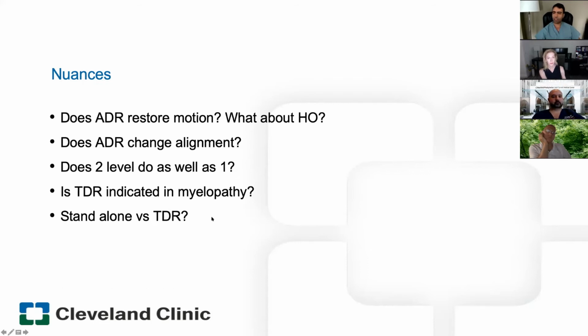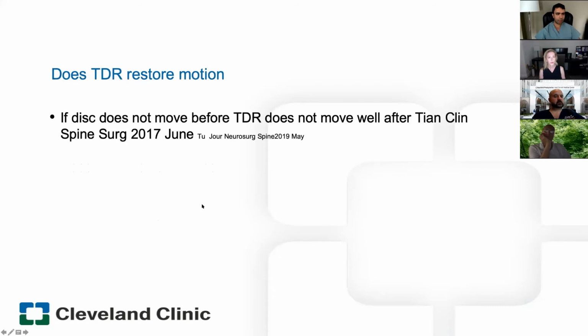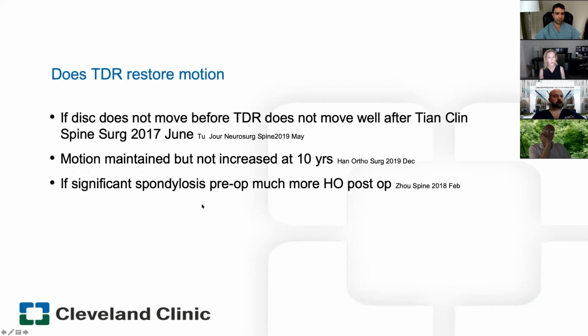And then there's some question about why do a cervical disc arthroplasty when you could do a standalone ACDF? Because if you think about it, there's no plate involved, and they're very similar in terms of the technical nuances. So there's some people who would favor that versus TDR. So speaking about this, does the TDR restore motion?